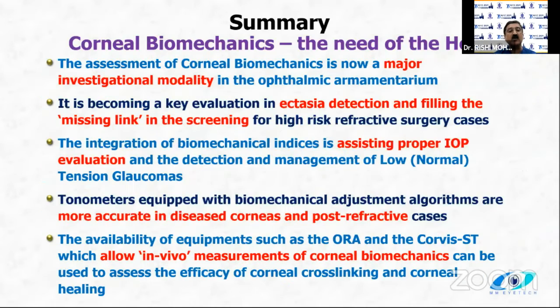So the biomechanics are the need of the hour. They're a major new investigational modality. They are key in ectasia detection, and they're filling the missing link in the screening process. They assist proper IOP evaluation, and the tonometers, which are now coming with biomechanically adjusted algorithms, are more accurate, especially in the diseased corneas and the post-refractive cases. And these machines are allowing an in vivo measurement of corneal biomechanics that can be used to assess the efficacy of corneal healing. So thank you so much.